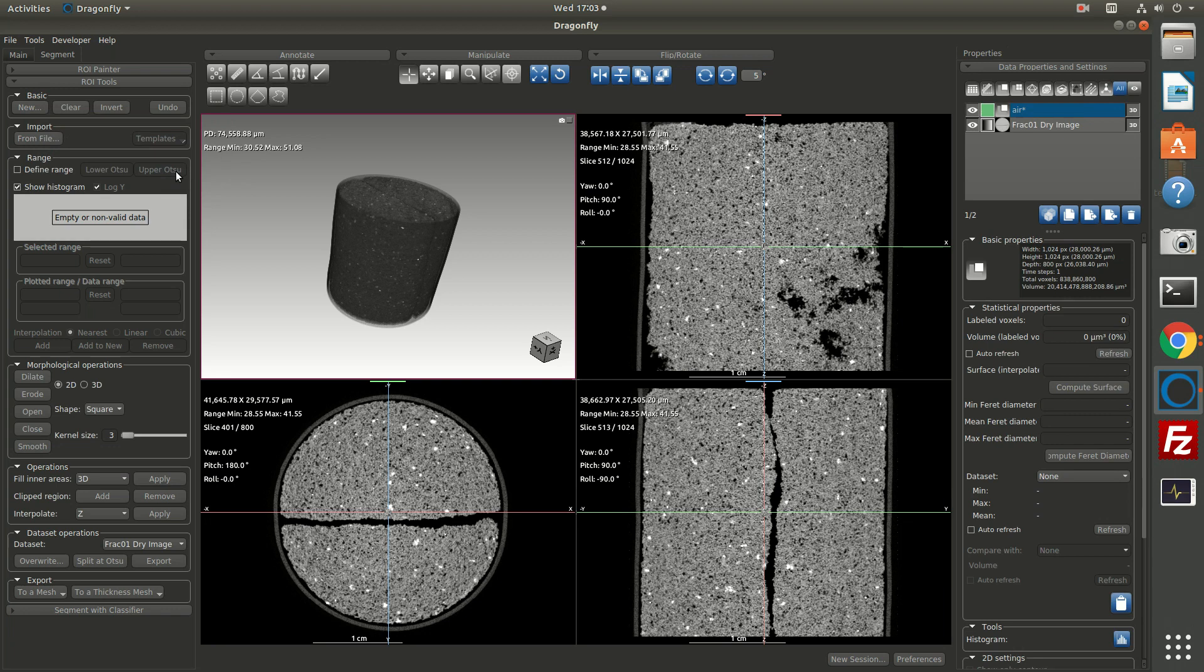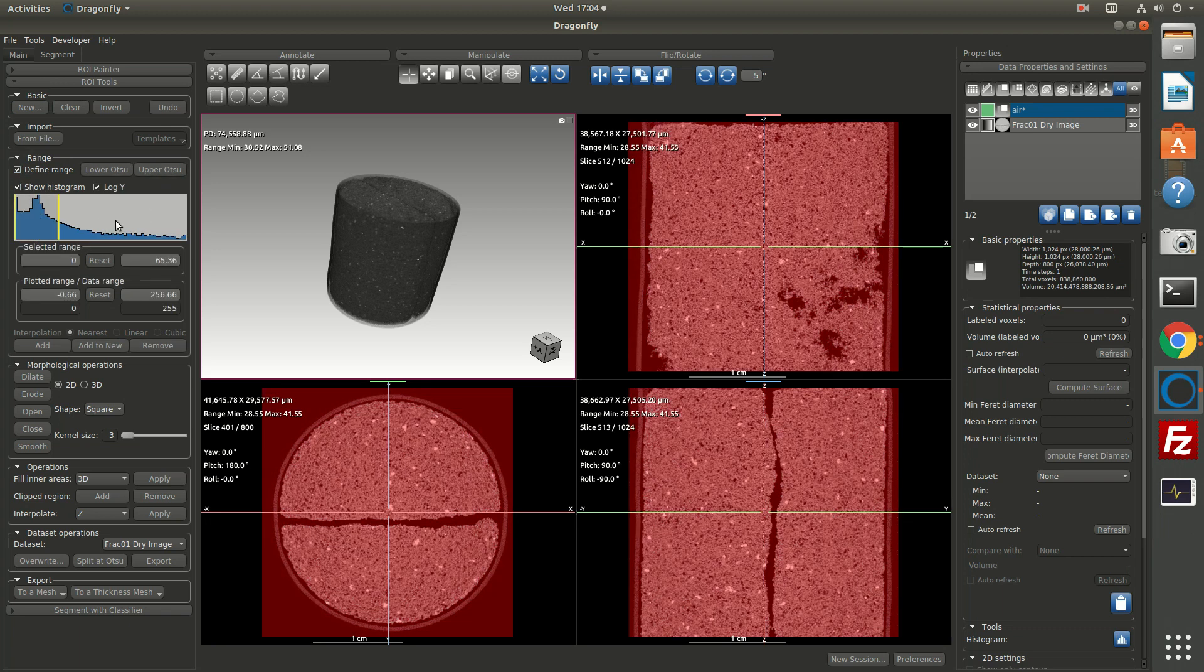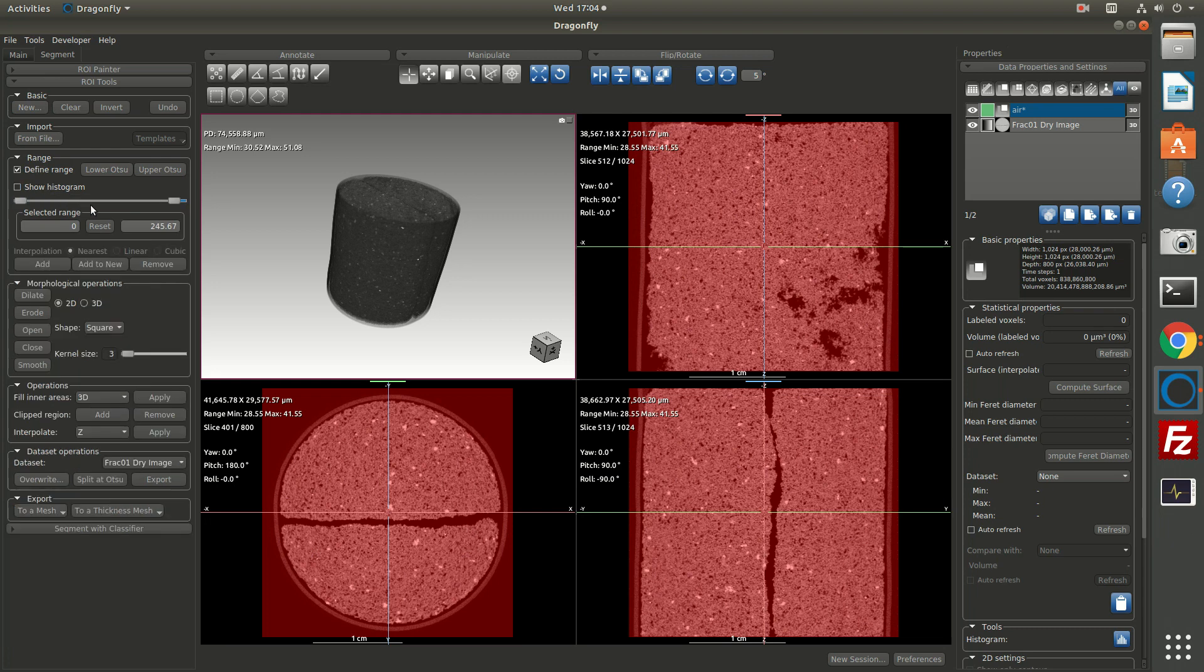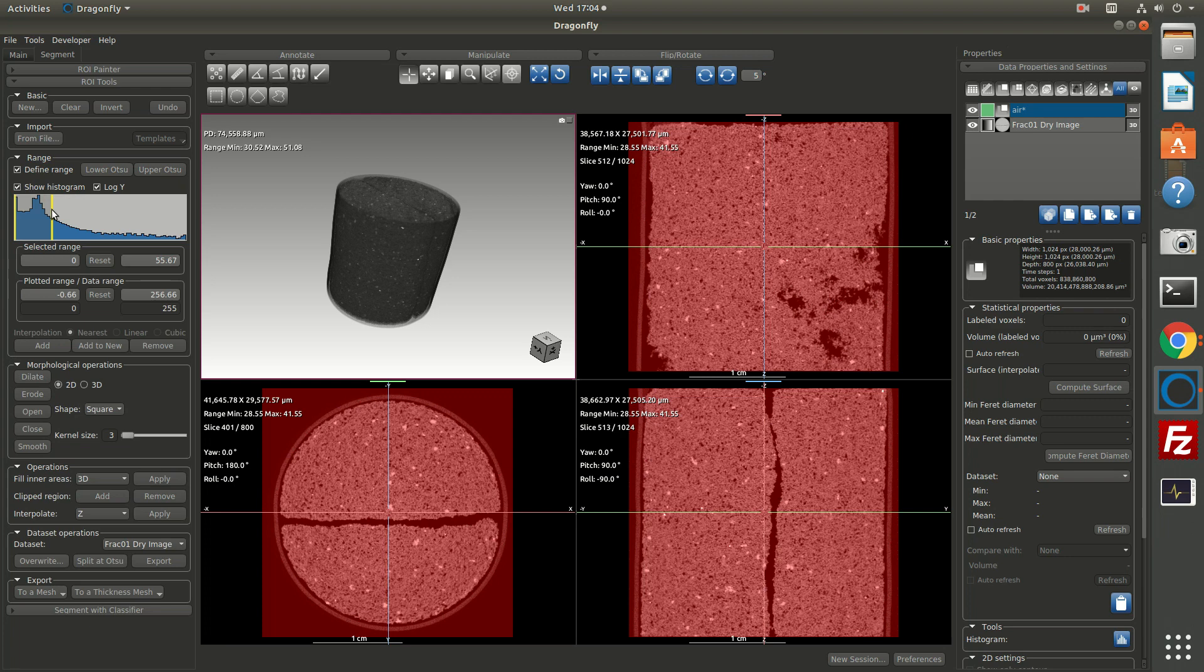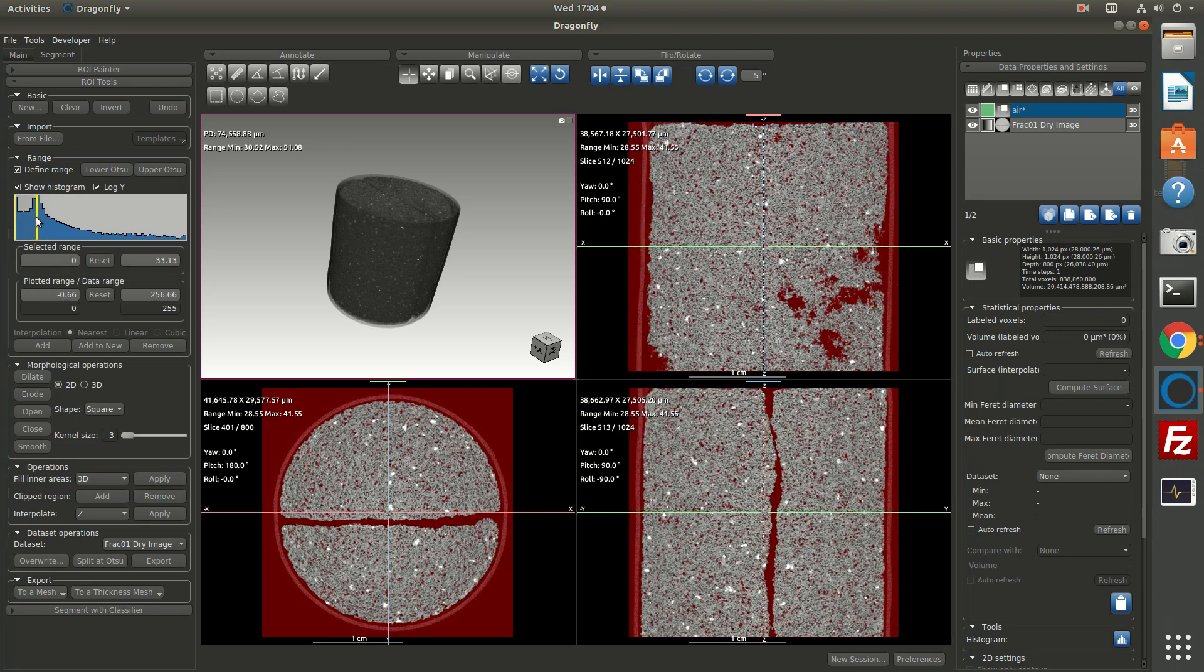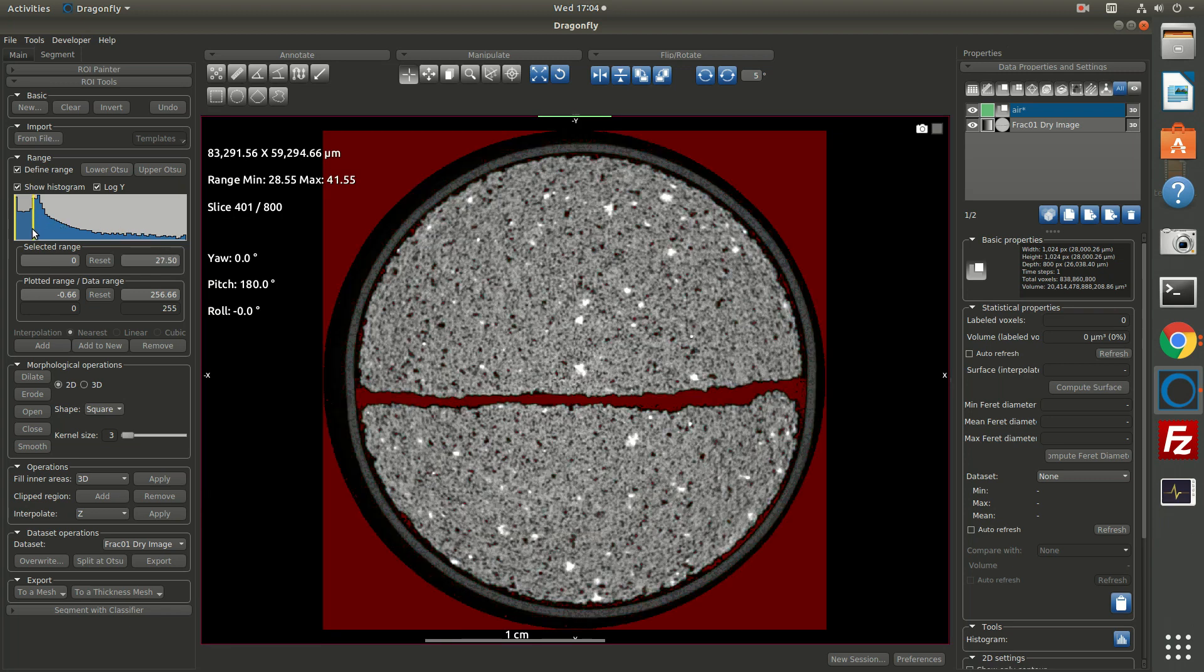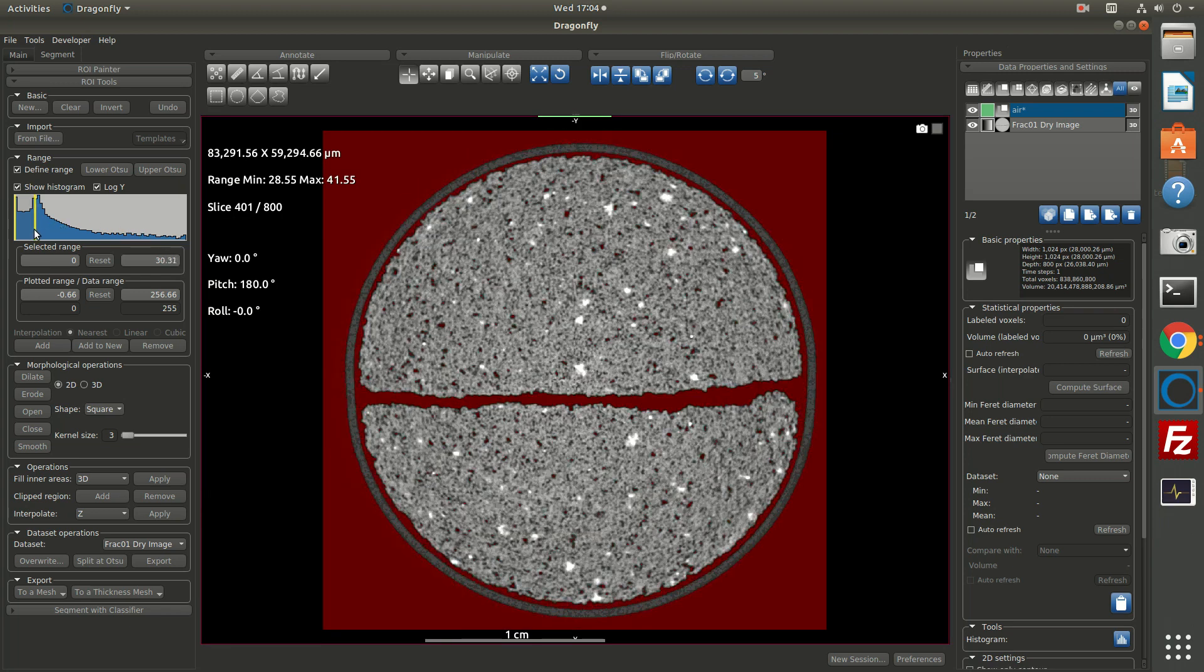Now what I can do is I can paint on this image, or I can threshold, or I can do other things. We see many tools on the ROI tools panel. If I click define range, then I have the ability to drag these sliders, and it might help if you do enable show histogram. So I want to select all of the air pixels in my data set. So I'll double click here to enlarge.